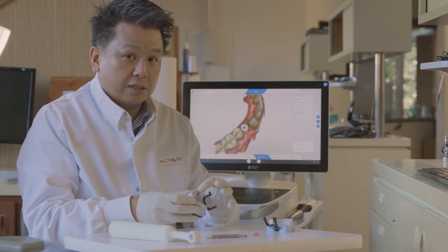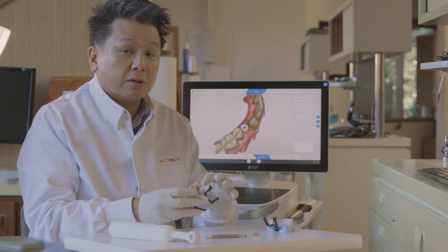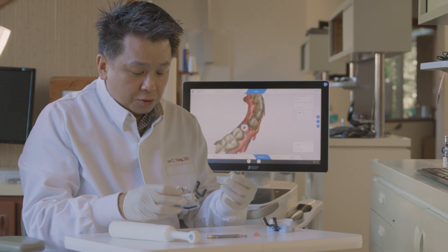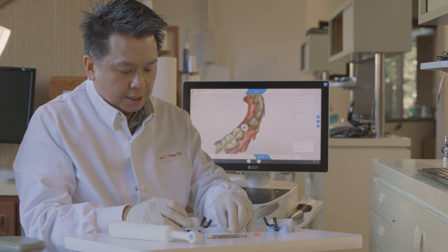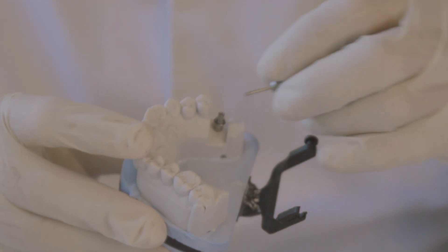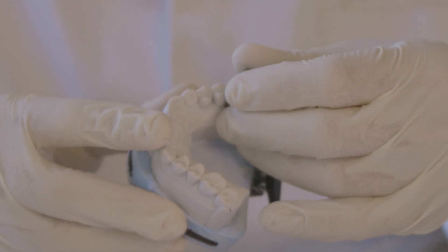Because if it's not aligned perfectly, it will affect the seating in the mouth, and sometimes it will feel like it's not going to engage correctly. You just have to pay attention to those small details. Assuming everything is good, you can see that the Roto abutments are already in place. You just want to make sure that it's snugly fit onto the analog.